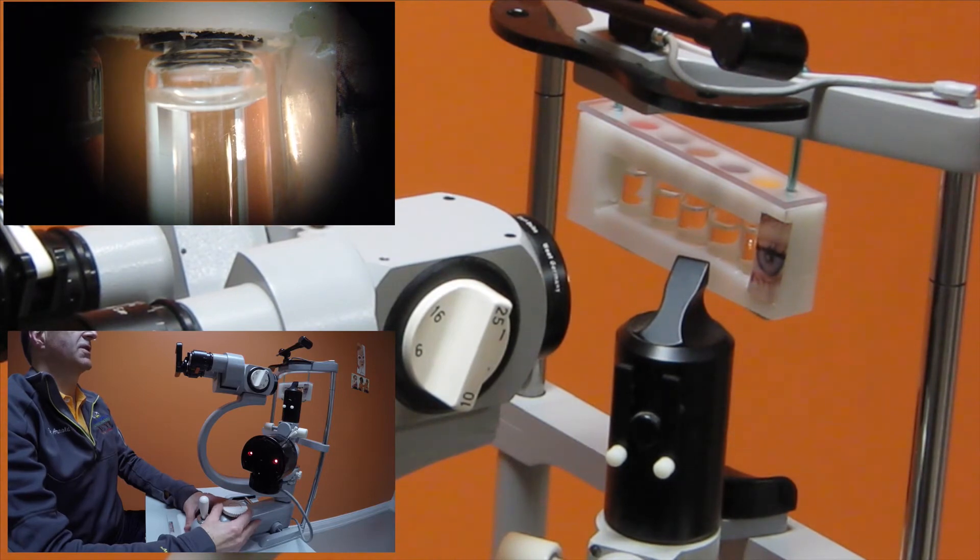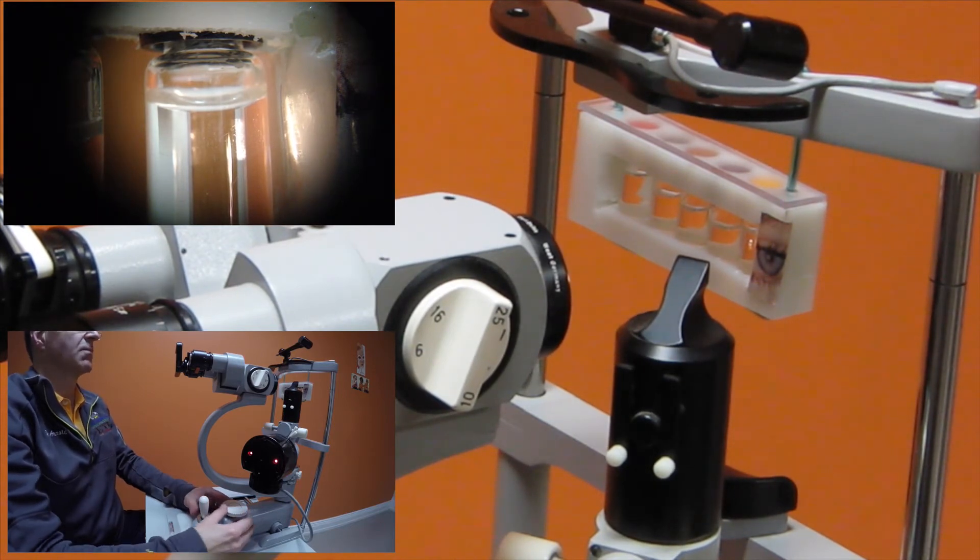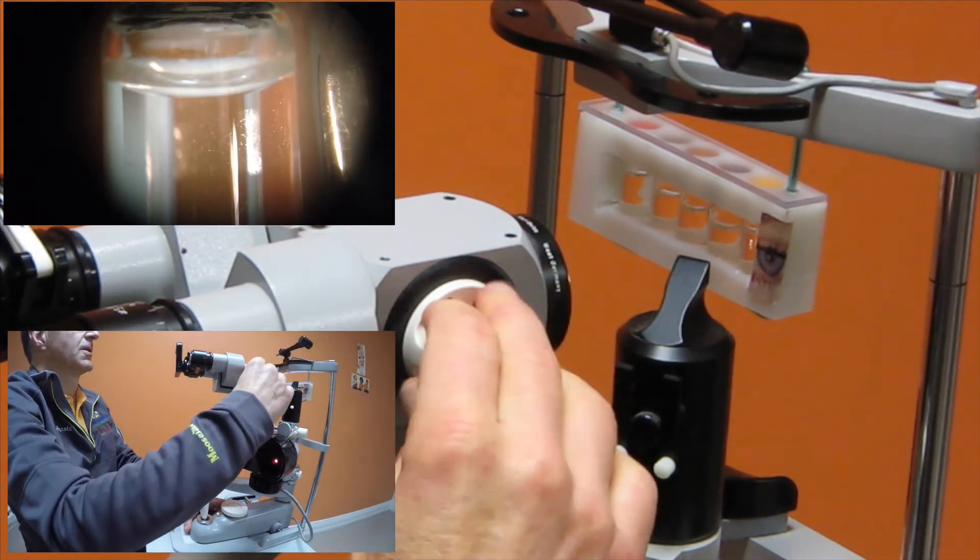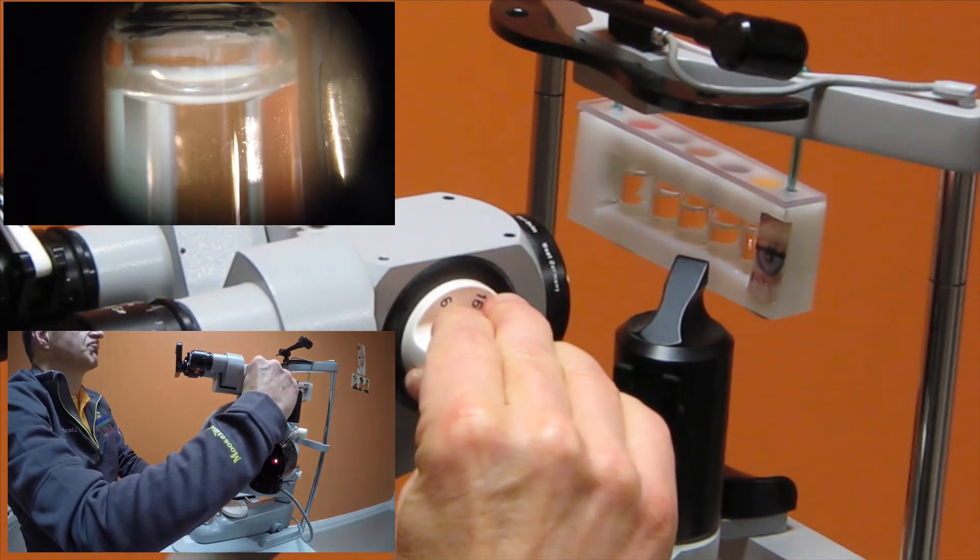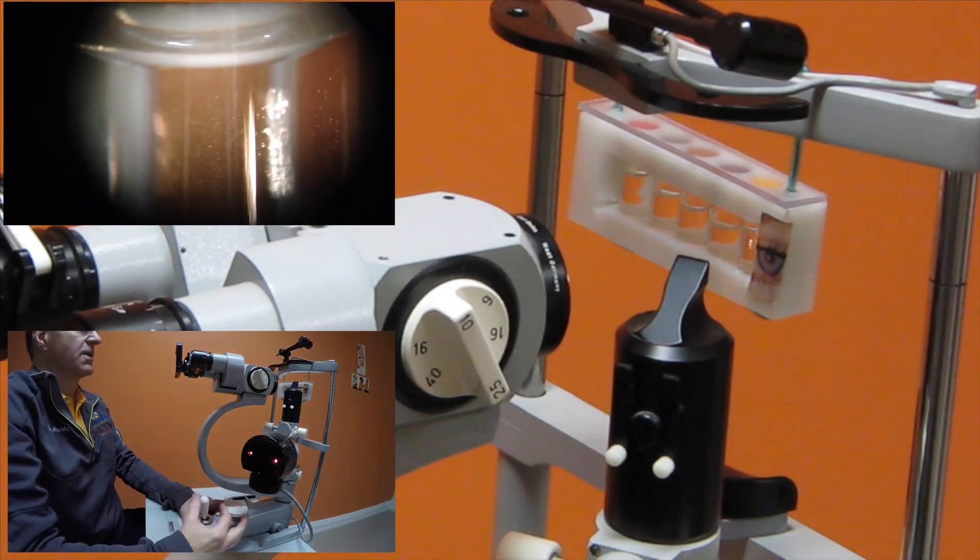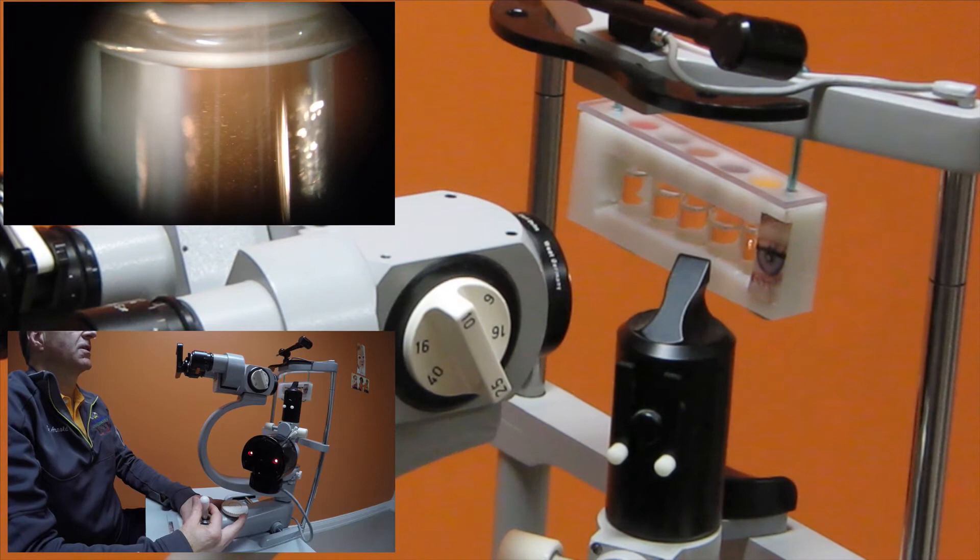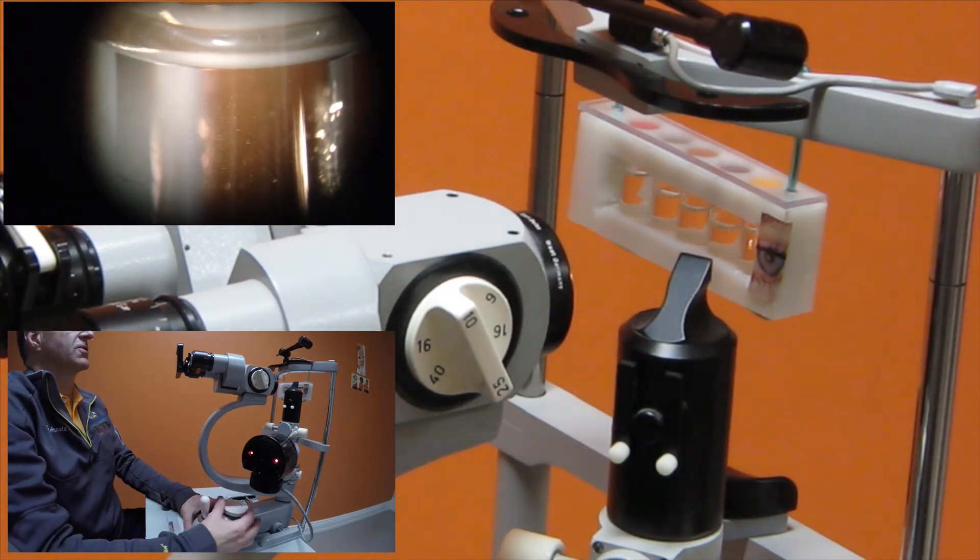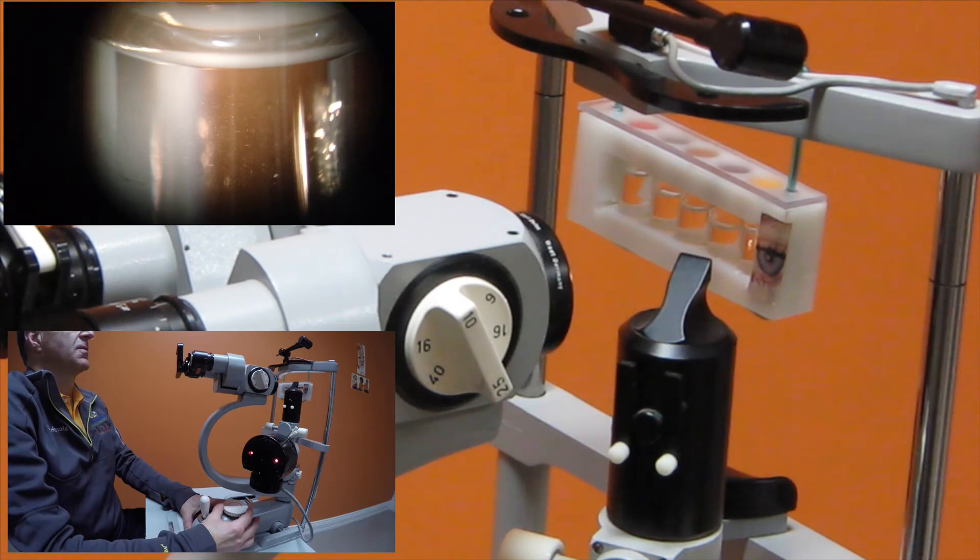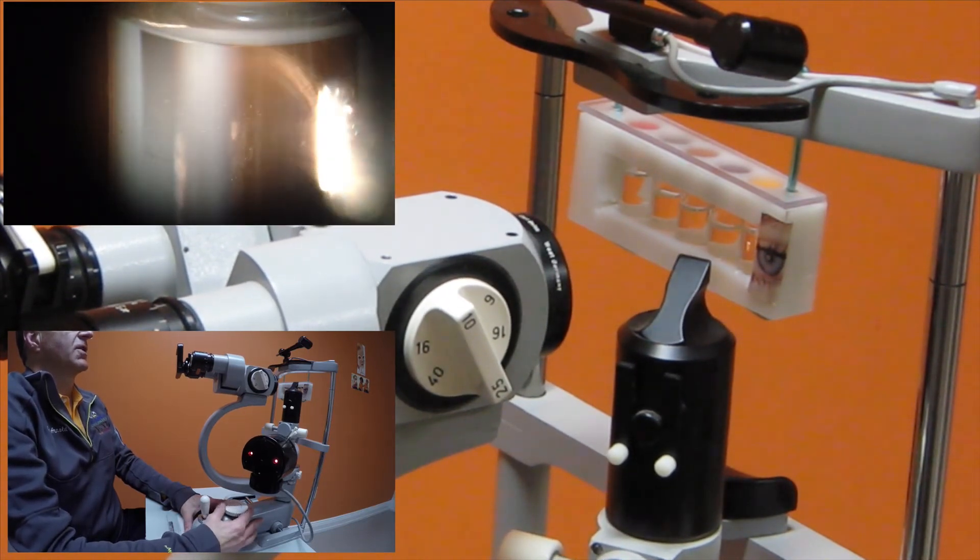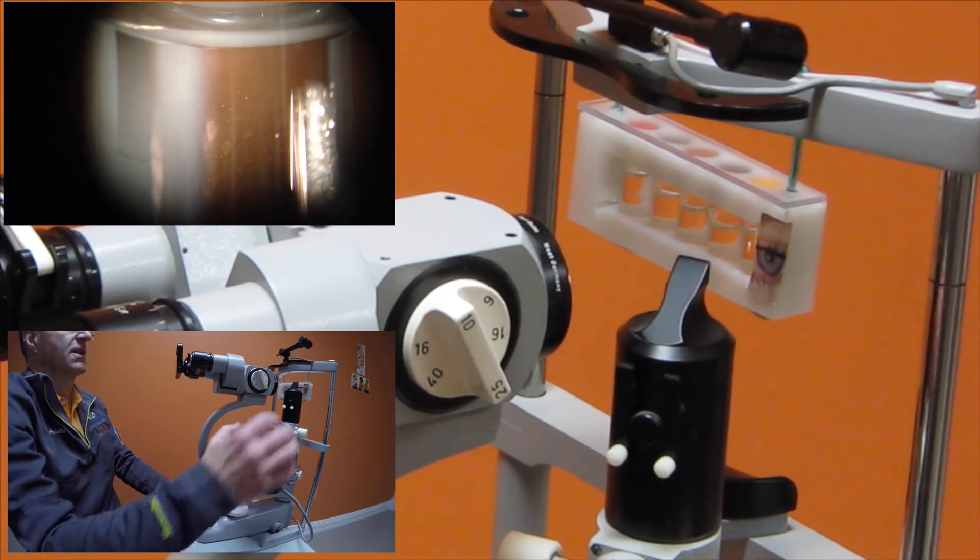As we're looking in the iritis test kit, we can actually see white blood cells and we're going to increase the magnification of this slit lamp. We will carefully move in so that our focus allows us to see the suspended white blood cell-like particles in the iritis test kit.